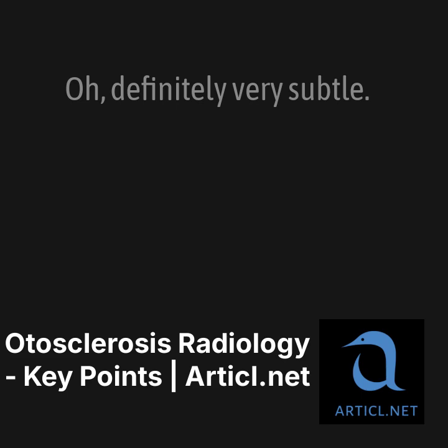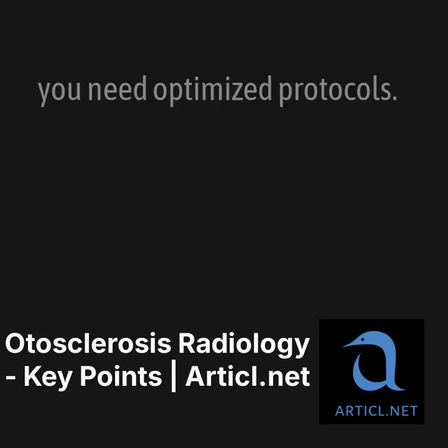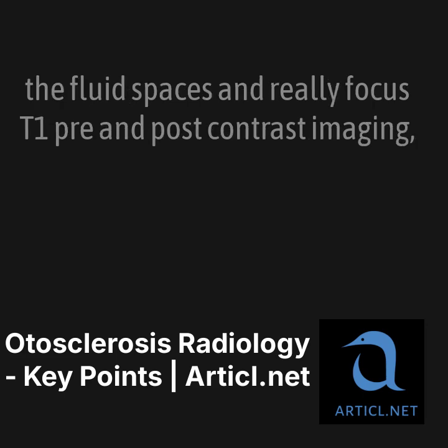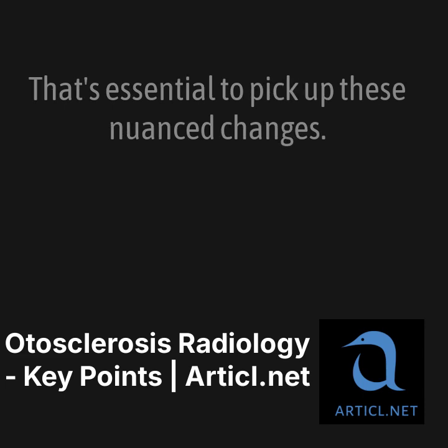Oh, definitely. Very subtle. You could easily overlook them if otosclerosis isn't really on your radar initially, which means you need optimized protocols. Like what? High-resolution sequences, definitely. Things like dedicated CISS or FIESTA sequences are great for the fluid spaces. And really focus T1 pre- and post-contrast imaging, paying close attention to those specific locations. That's essential to pick up these nuanced changes.